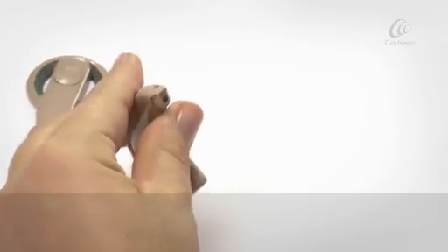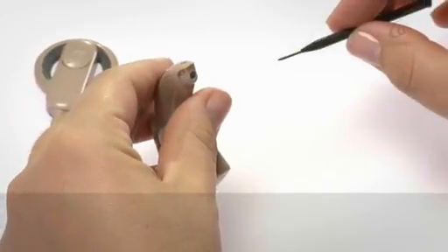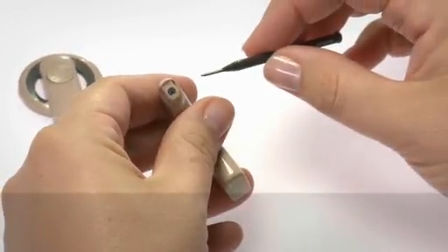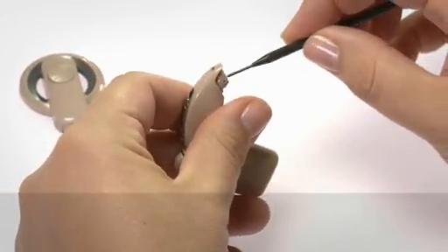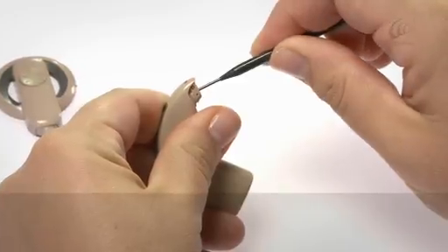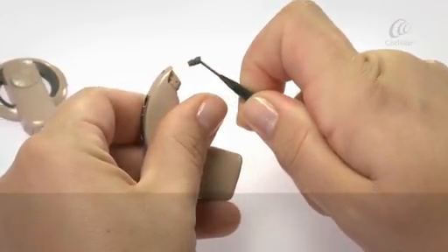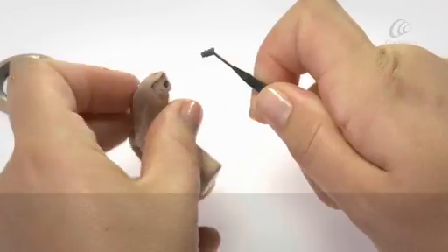Insert a Cochlear EAC 200 series screwdriver into the hole in the processor unit plug. Use the screwdriver to carefully remove the plug and discard.